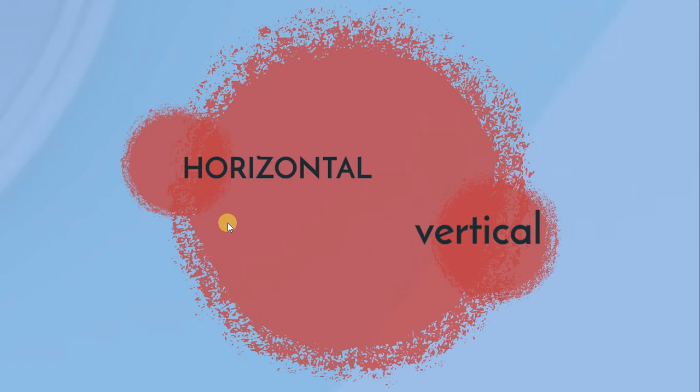There's a rule: we shouldn't do a vertical incision on the palatal side, and also on the lingual surface of the lower, you shouldn't do any vertical incision, because it's difficult to stretch or displace the flap palatally. So I think it's forbidden to do any vertical incision palatally.